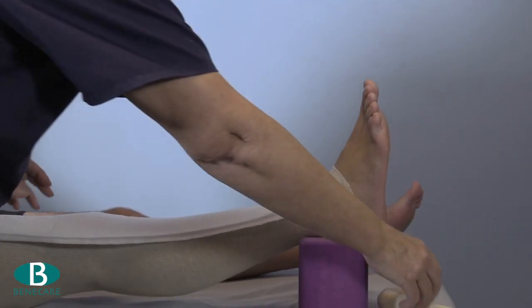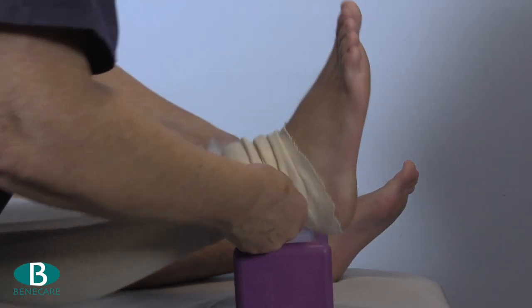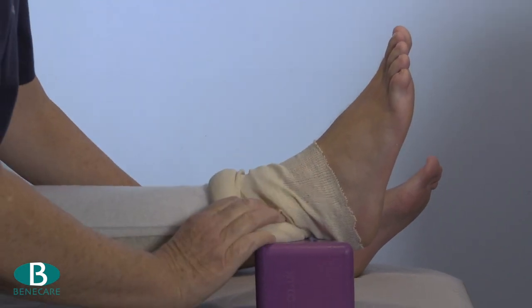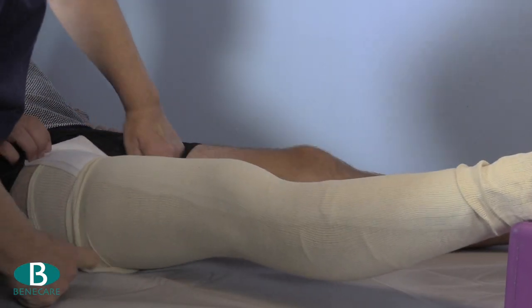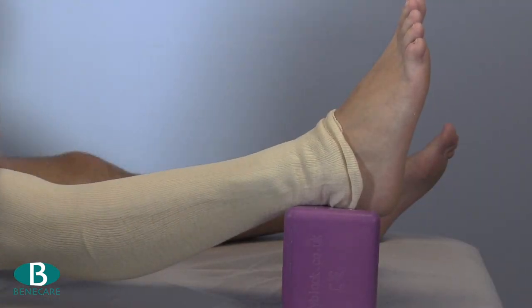Now apply the padding. I have used a double layer of undercast padding, but adhesive felt is often used. Then apply a second layer of stockinette as with the first layer. Ensure all layers are smooth and wrinkle free.